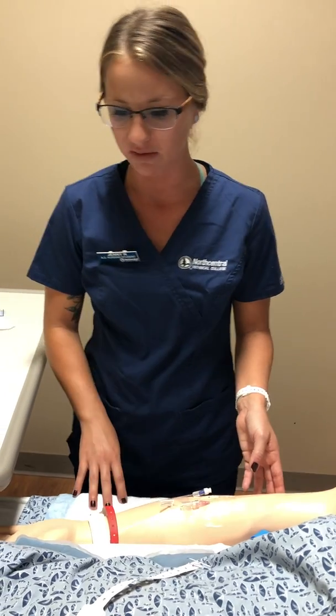And so before leaving the room, I want to make sure all safety concerns are addressed, that the bed's in a low position, that she's got her call light within reach, all her personal items. If she's a fall risk, make sure that she knows to call for help when she needs to get up out of bed. And it seems like she tolerated it well, so I'm going to wash my hands.